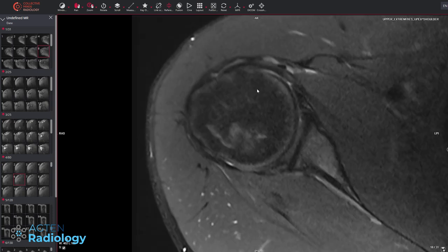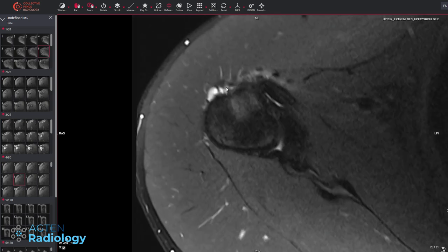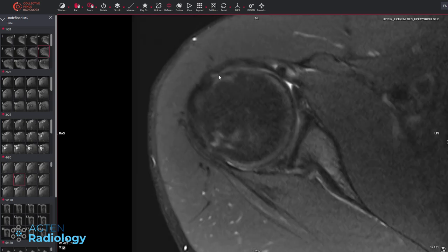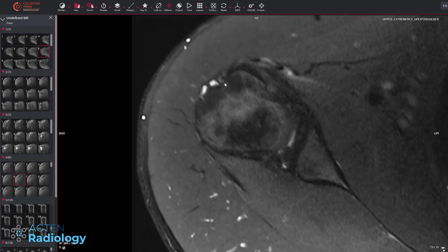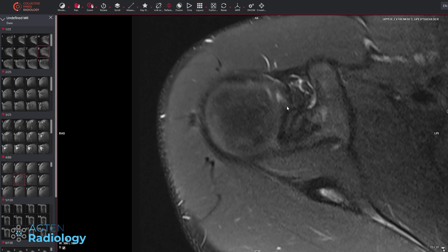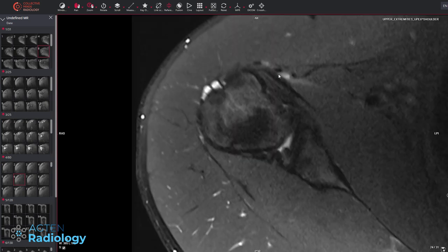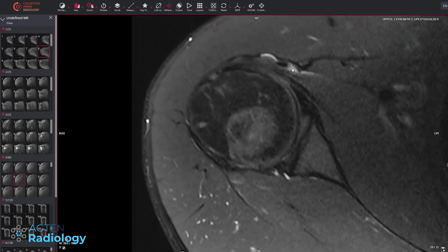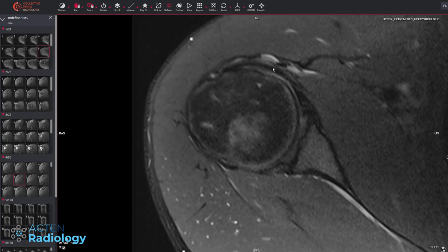On the axials, we try to identify the long head of the biceps tendon and it's not sitting in the groove — there's nothing really going down. This tiny black dot could be part of the aponeurotic expansion, not an artery, and certainly not the proper biceps tendon. Actually, this is the biceps tendon — you can see it goes from the anchor, outside of the joint, superficial or anterior to the subscapularis tendon, going down. So we have a medially dislocated long head of the biceps tendon with some surrounding edema — possibly post-traumatic.